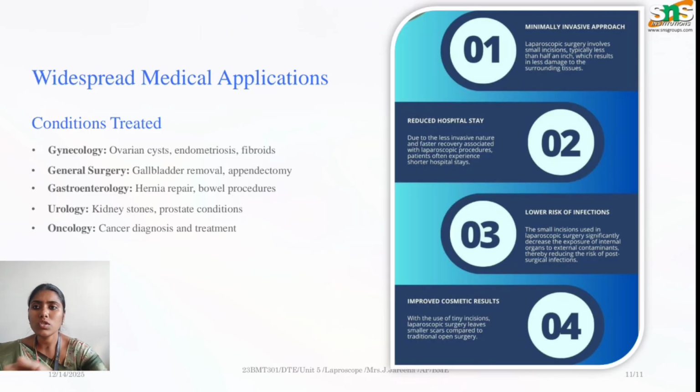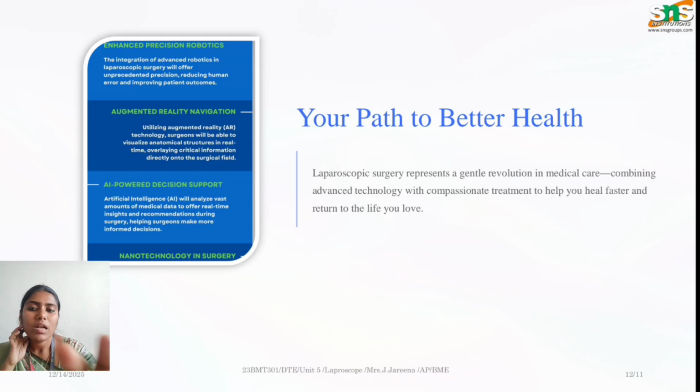The wide applications are gynecological issues, general surgery, gastroenterology, urology, that is kidney stones and prostate conditions, and finally oncology also. So what we want to conclude on this topic is that laparoscopic surgery is very much recommended in cases where normal surgery doesn't have the option to access particular internal organs, and also where magnified visualization is needed.